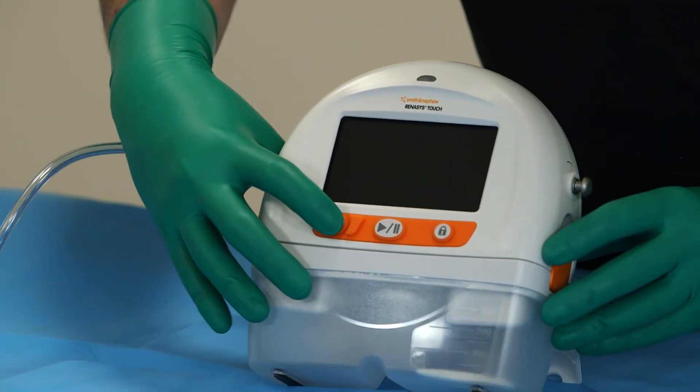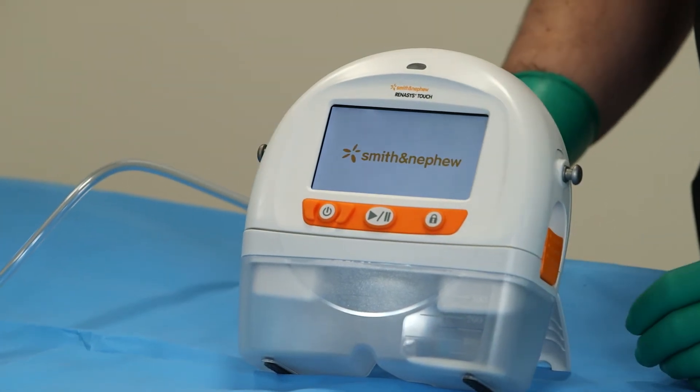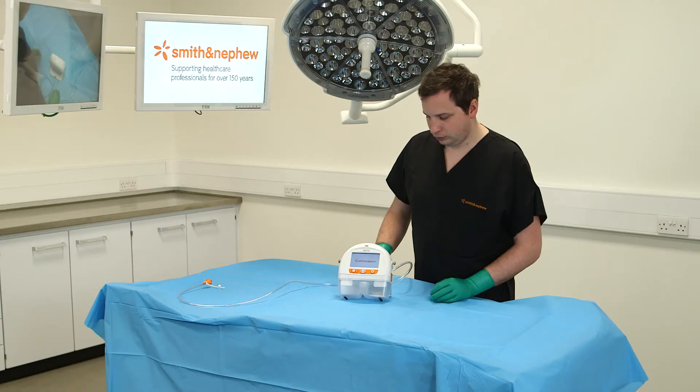To turn the device on, press and hold the power button for 2 seconds. The touchscreen will illuminate and initiate the start-up sequence.